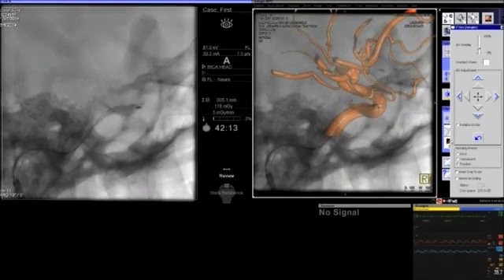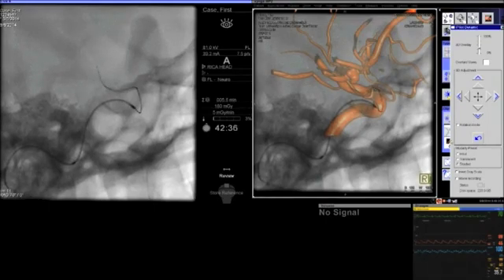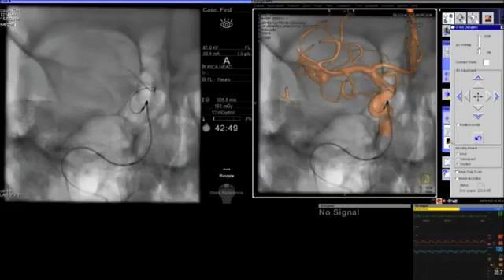and perhaps one of the most important tips of this technique is to always consider catheterizing first the most challenging vessel of the bifurcation. In this case, we felt it to be the superior branch of the middle cerebral artery bifurcation. We also used a 6 French Neuron guide catheter over a Select to catheterize the internal carotid artery. The patient was fully heparinized with an ACT of 250, and the PRU and ARU levels were therapeutic.